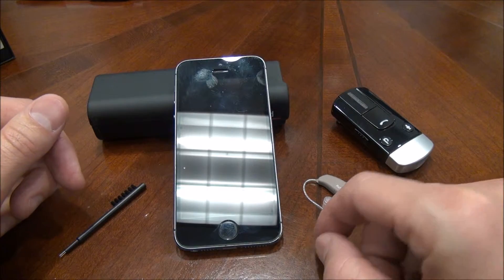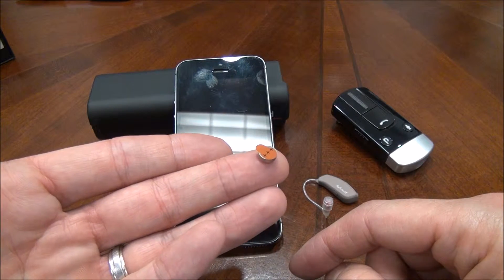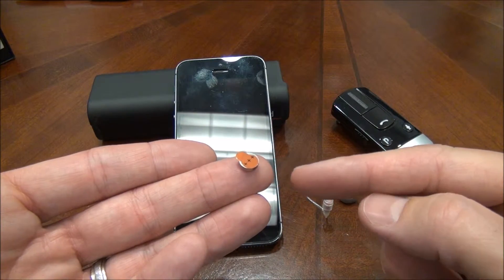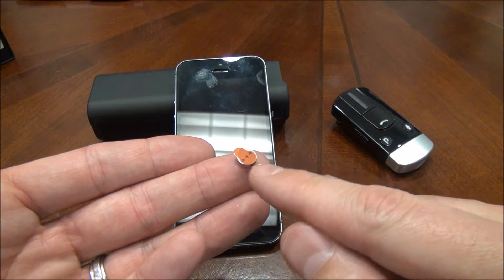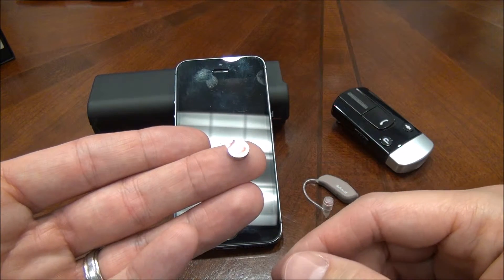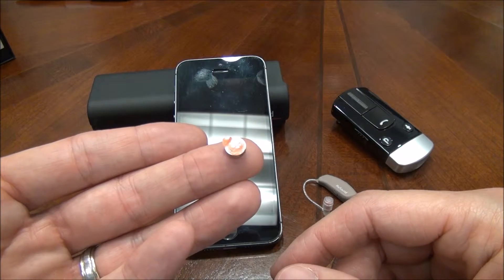So with this type of device, most of them take a battery that looks like this. It's called a 312 battery, and the 312 battery is easy to identify by the brown color — either the tab will be brown, or the casing, the storage case, will be brown itself.